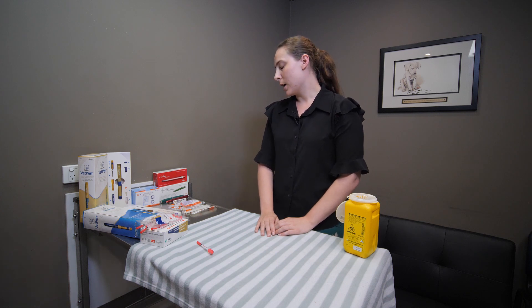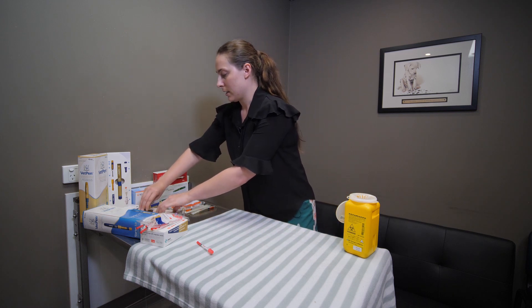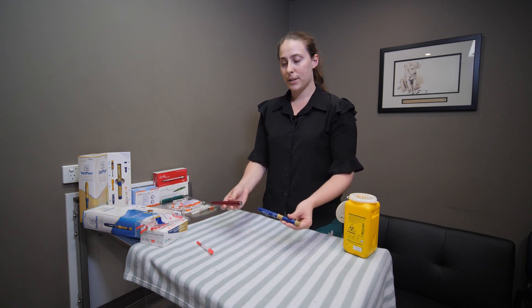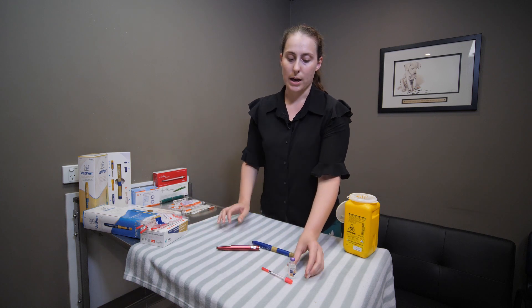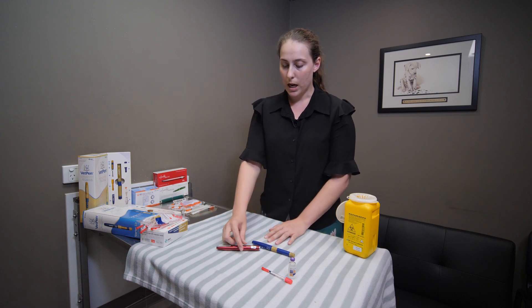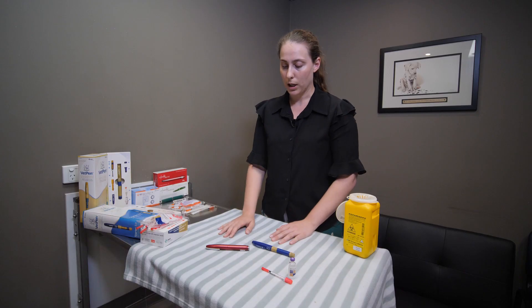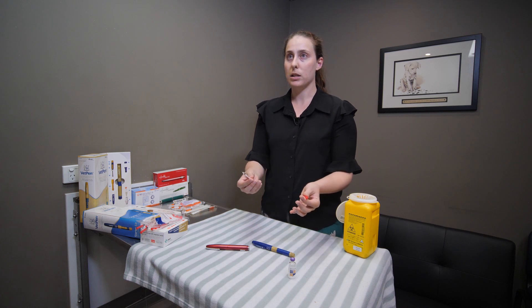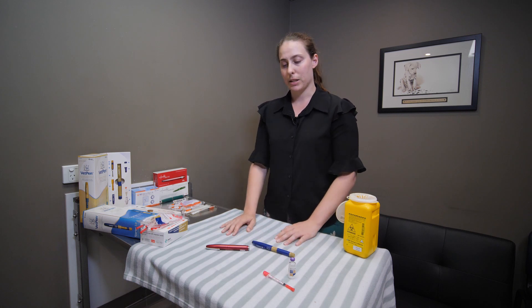Your vet might have recommended the use of an insulin pen, and I've got a few devices here as examples. There are a few different products on the market. Reasons for using a pen over the traditional technique of needles and syringes include needing a very low dose, as a pen is more accurate compared to manually drawing it up. You might also find that you're not comfortable with needles, and a pen device can be a little less daunting.